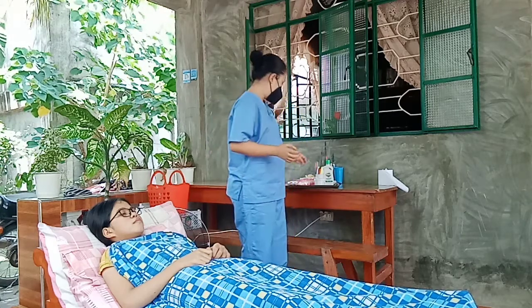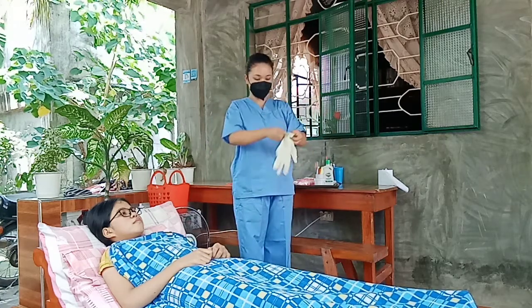Number 3 is collect clean voided urine specimen. So number 1 is apply clean gloves, then give patient supplies to clean the perineum. So apply clean gloves.